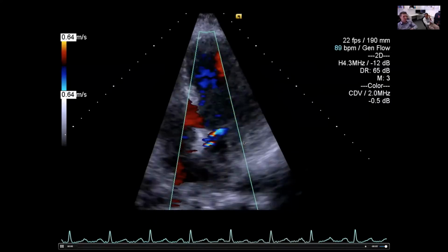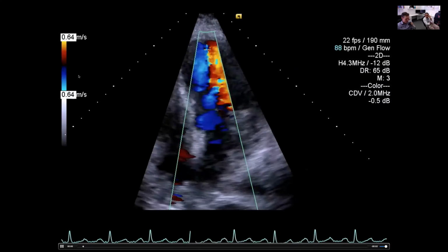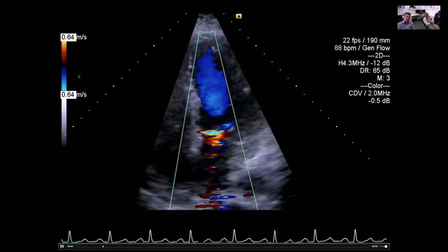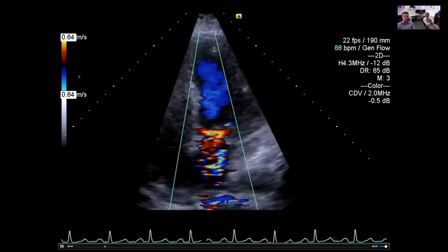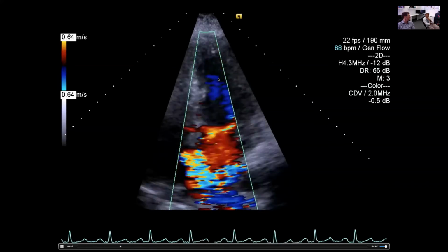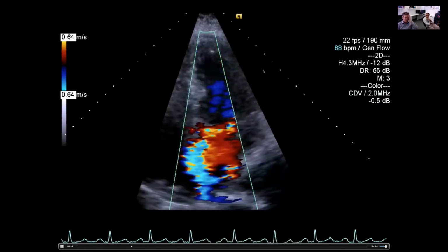So it's reaching the scale's better, isn't it? That's right. Yeah, scale is better, and it's occupying the whole left atrium, and even reaching the pulmonary vein. And reaching at the back of the wall, which is suggesting it can be significant. It's important to note that the left ventricle is contracting well. Yep. And again, we can probably bag up my picture.